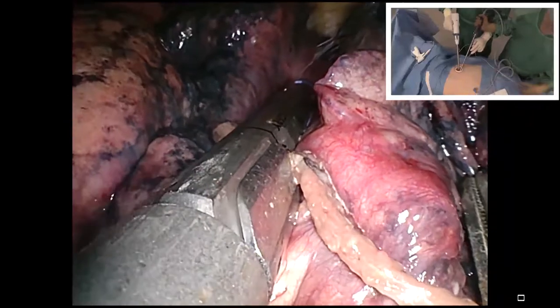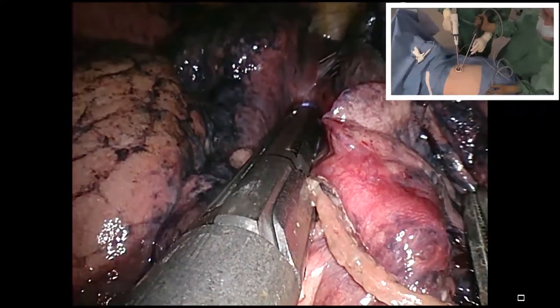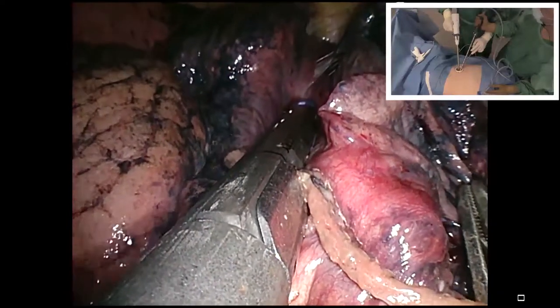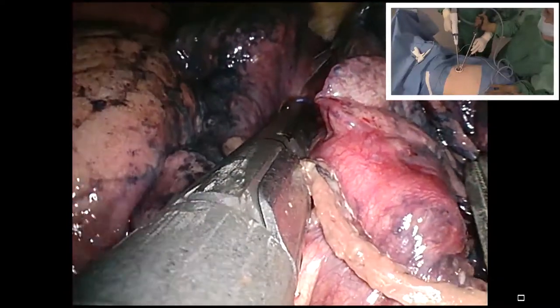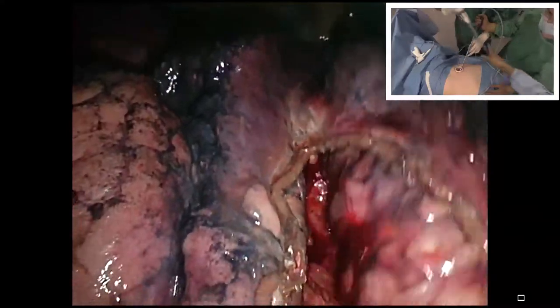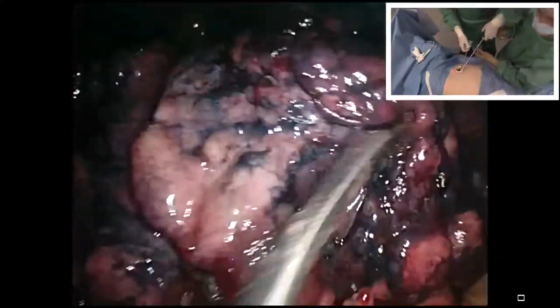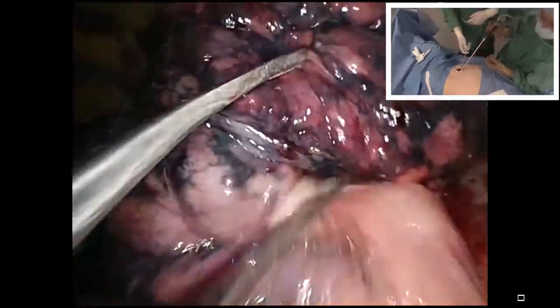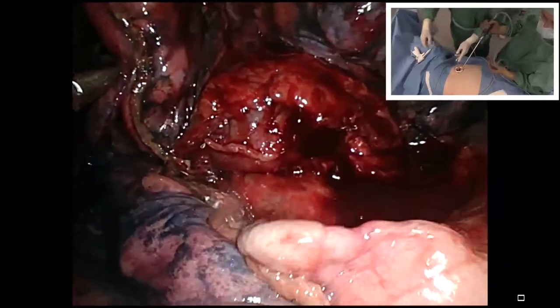So, open the magazine. I think Diego didn't dissect the A2 now. No, the A2 is for the end. Because in the sleeve, the A2 is very close to the bronchus, so you have to be careful.